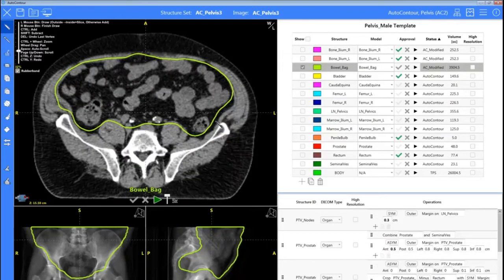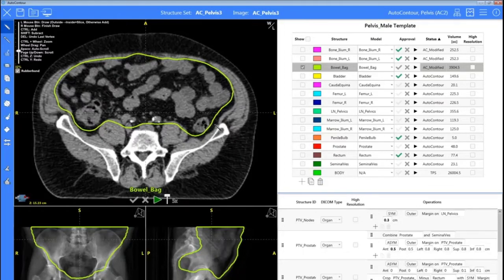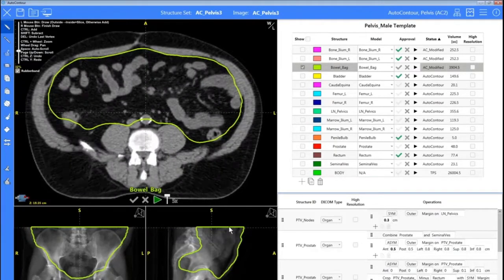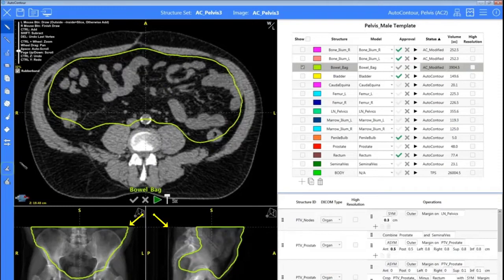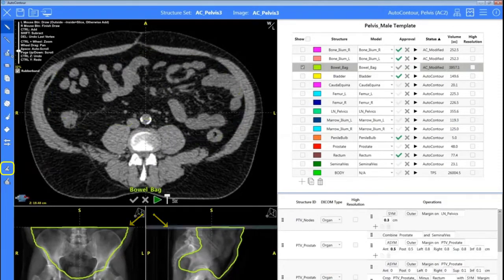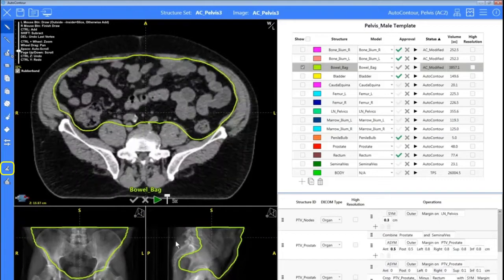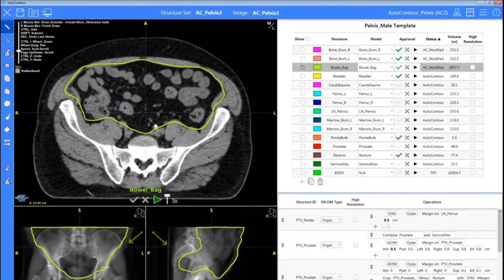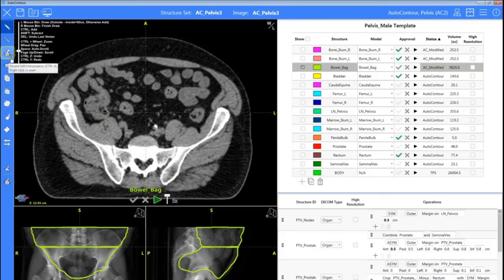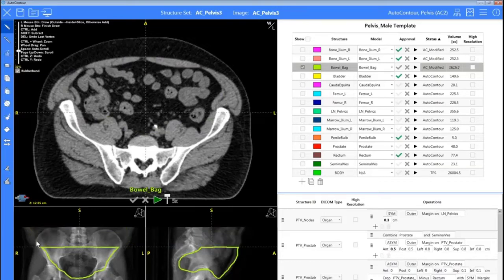This is also great for getting rid of the bulk of a contour if you don't necessarily need the full contour. I'm going to go to our most superior slice here, clear this plane, and then bring my crosshair down to where I'd like the bowel to stop. We'll clear here, and it's tracked those changes — a simple click and it's gotten rid of that superior bowel for us.